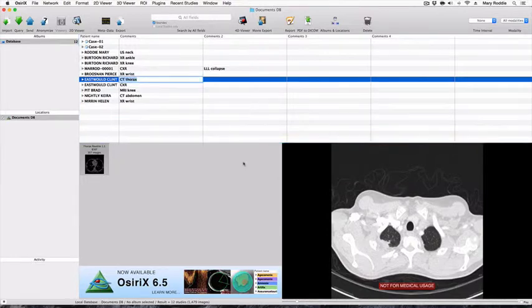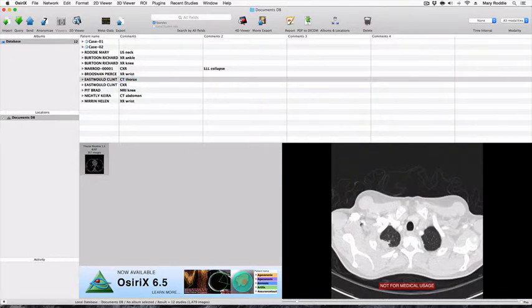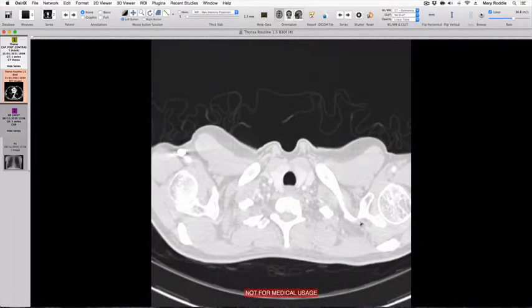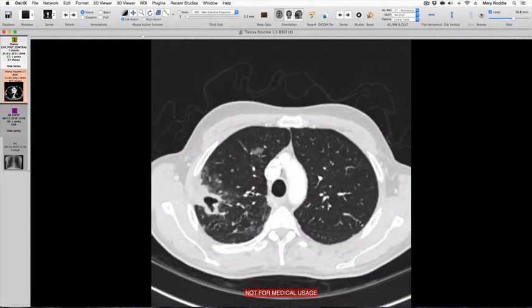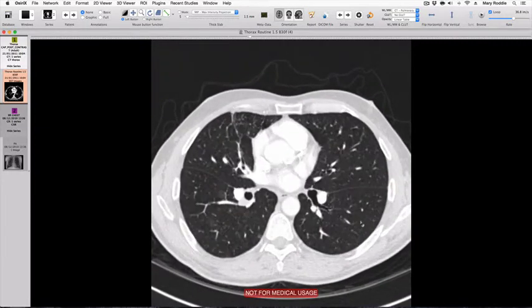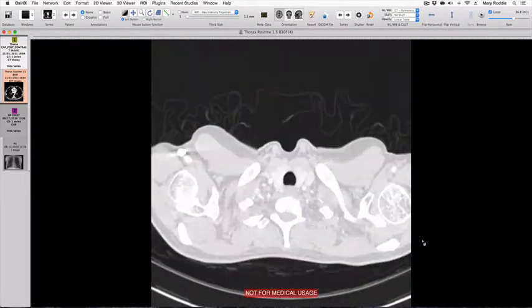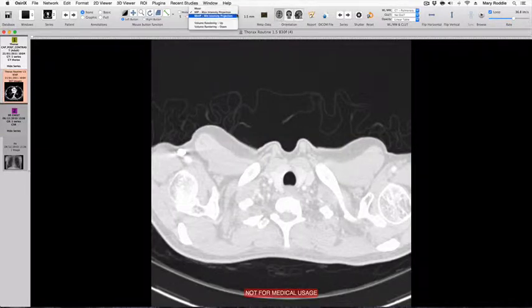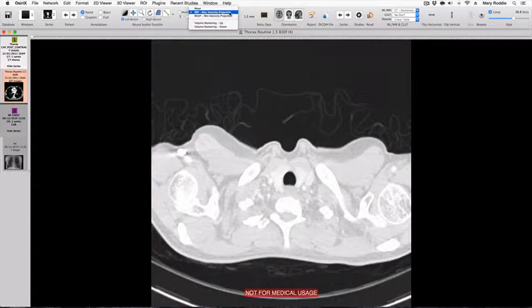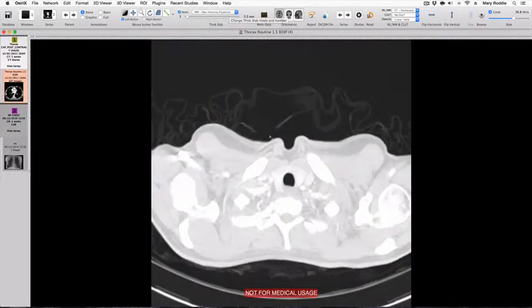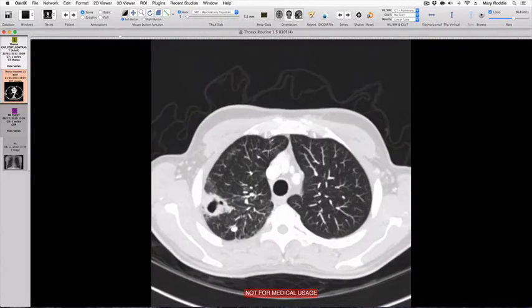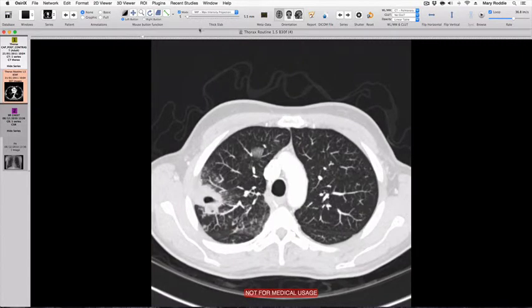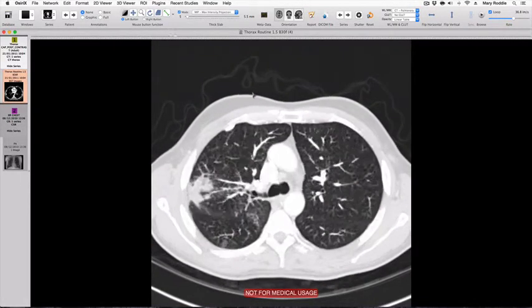For this task we will use the CT thorax of Clint Eastwood. These are the thin sections in the axial plane. To create the MIPs we need to go to the thick slab icon in the top toolbar and select maximum intensity projection. We will now see MIPs. These are 5mm thickness. We can change that up or down if we want.